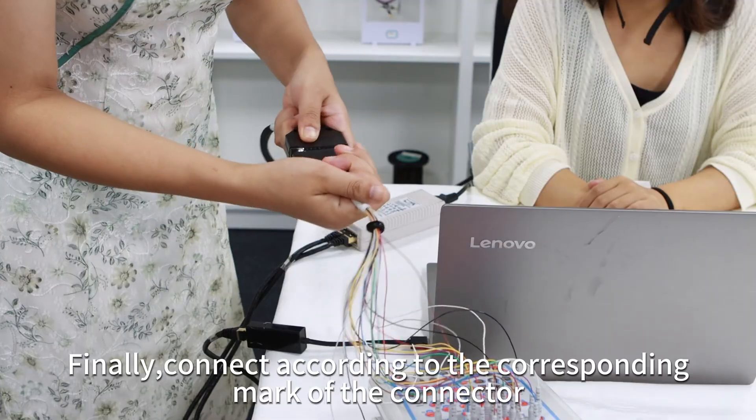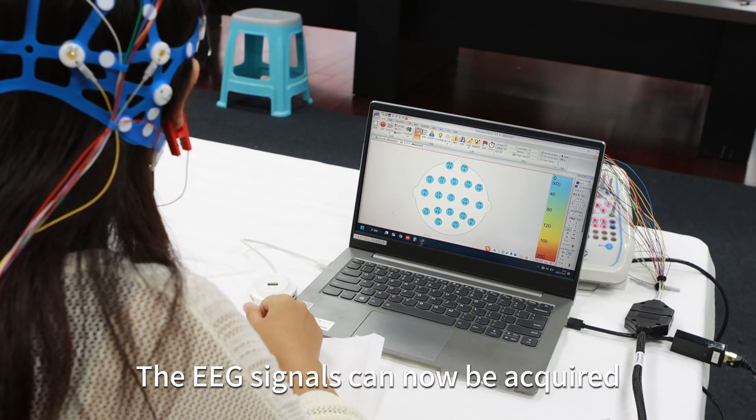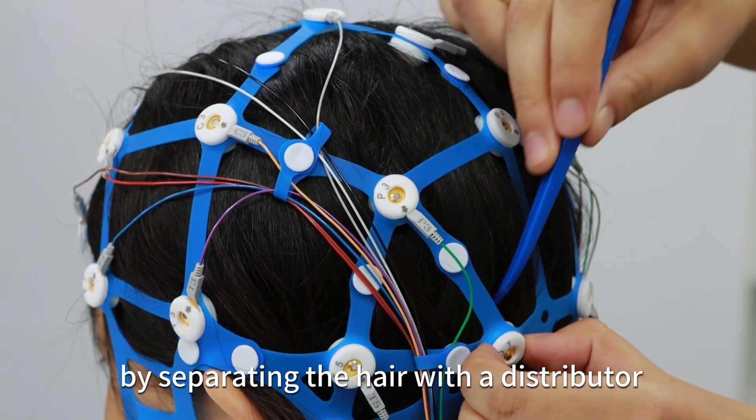Finally, connect according to the corresponding marks of the connector. The EEG signals can now be acquired. The impedance can be reduced appropriately by spreading the hair with a distributor.